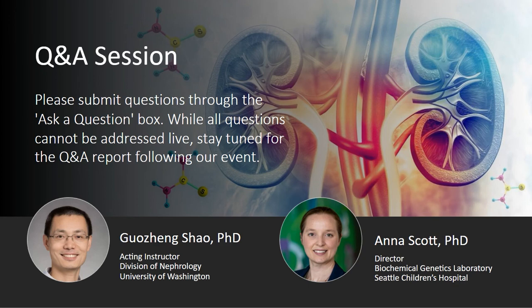Quantification of these gets a little bit hairier because we don't have calibration curves established, but there is always the possibility for a research collaboration where if there's a compound of interest that I know is detected in one of our methods but is not routinely quantified as part of clinical care or management, maybe because it's not relevant or there's other things that are more interesting from a management perspective, that doesn't mean it's not possible to set something up.